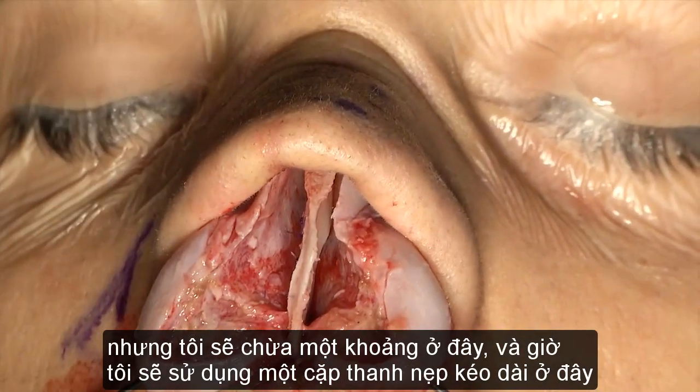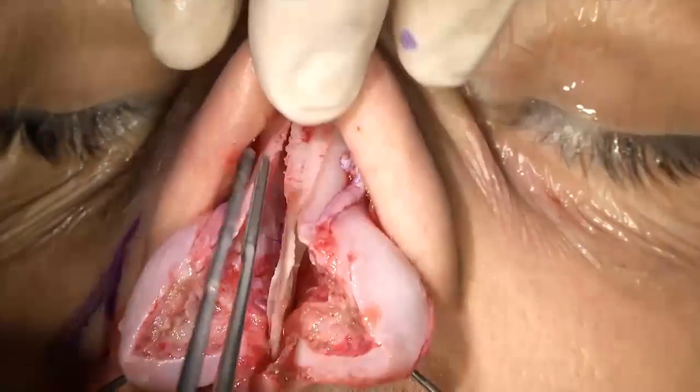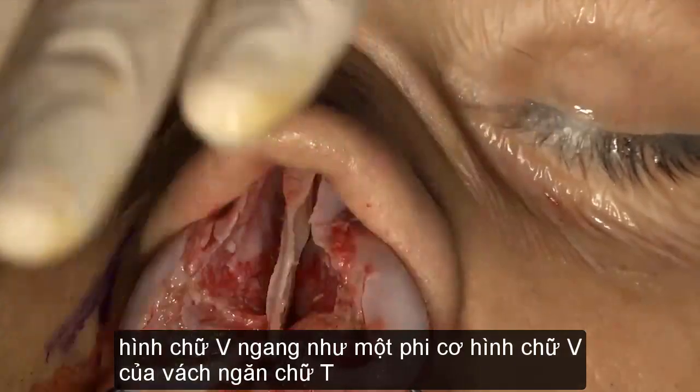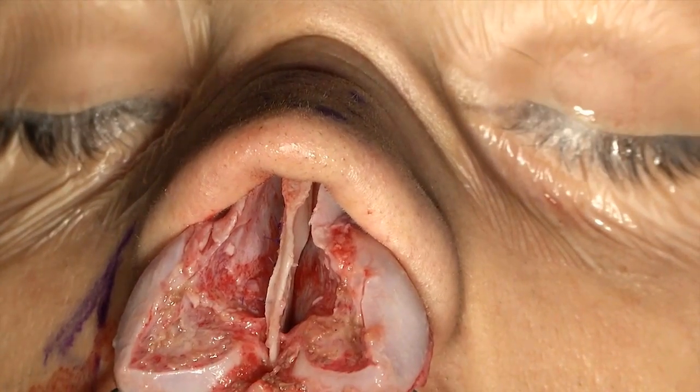So let's go for a couple of spreaders anyway, which will be below the horizontal V-shaped, like an aircraft carrier V-shape of the septal T.